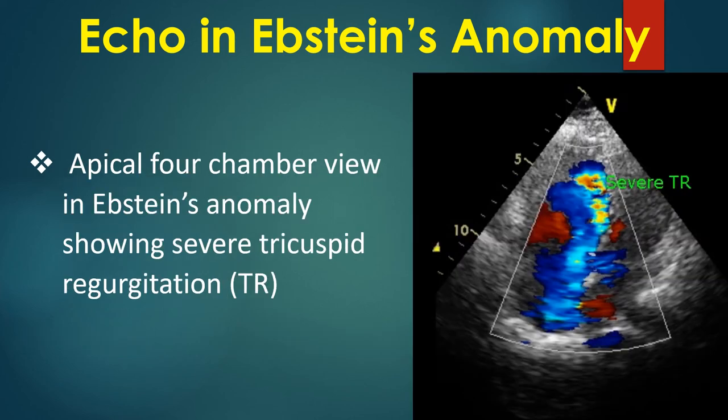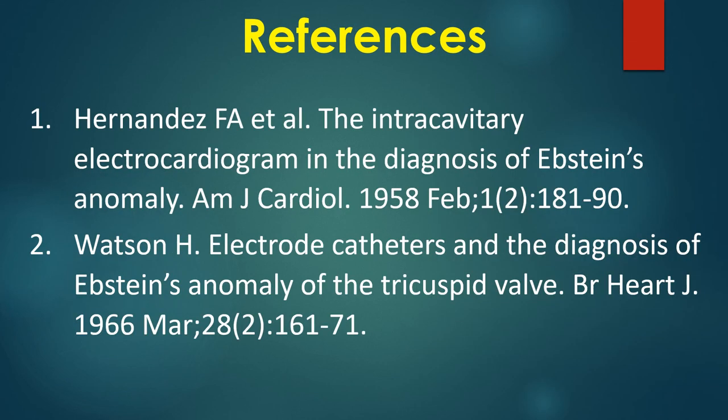Apical 4-chamber view in Epstein's anomaly showing severe tricuspid regurgitation. Here are a couple of journal references.